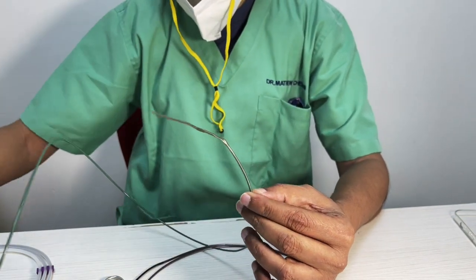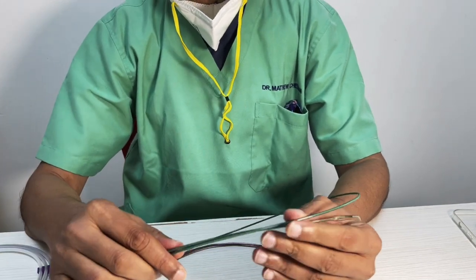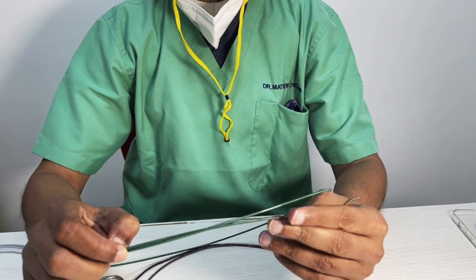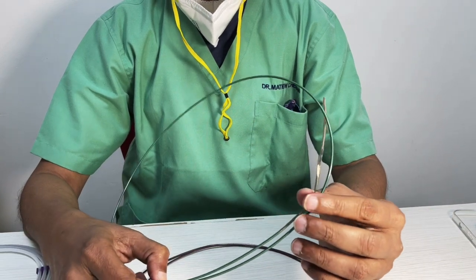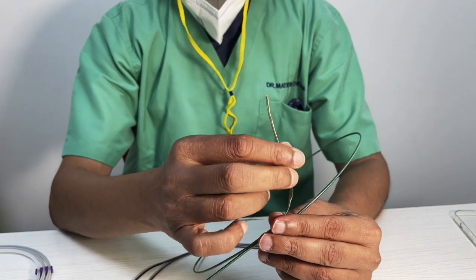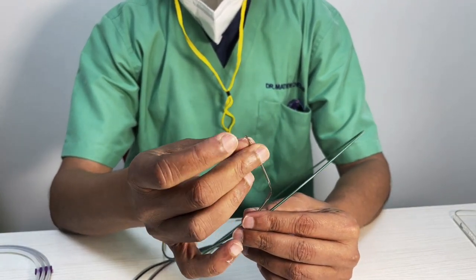Now, from here, I want to show you another distal access catheter. So remember, neuron is still good, but be careful when you're taking neuron over tight loops, because as you push and pull, you may kink it and it may get completely destroyed. This is the trade-off they got because of a fantastic pushability because of stainless steel and a spiral. But the problem is right to the end, you see, it can destroy the catheter completely.